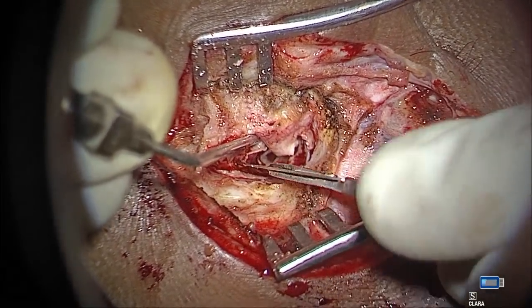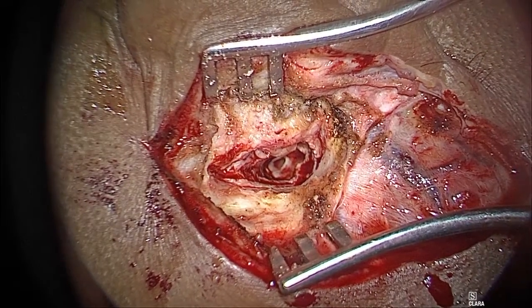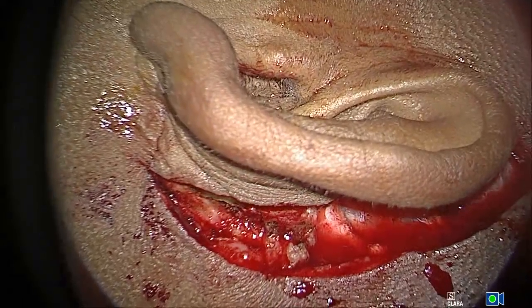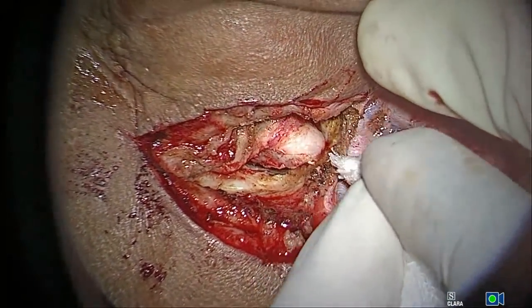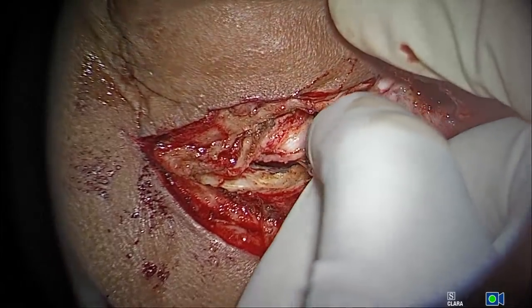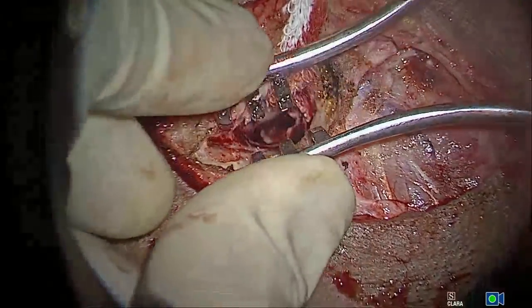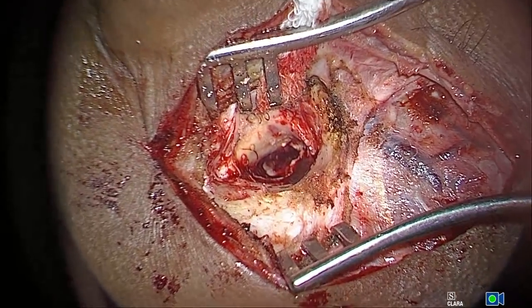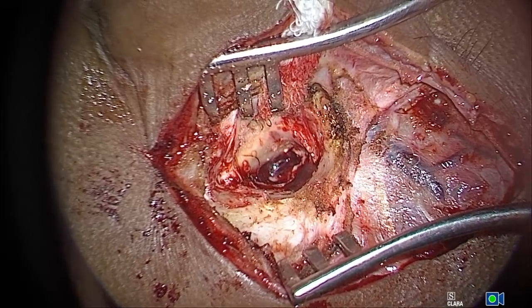It depends only on the status of the mastoid mucosa. If the mastoid mucosa is healthy, I generally avoid a cortical. I just don't do a cortical. But if it is edematous, then we generally do a cortical. Number two, if they have recent discharge, a discharging ear, then we will think of doing a cortical. So that is actually my criteria. Give me the, no, not this. So in this case, of course, we will not do it.